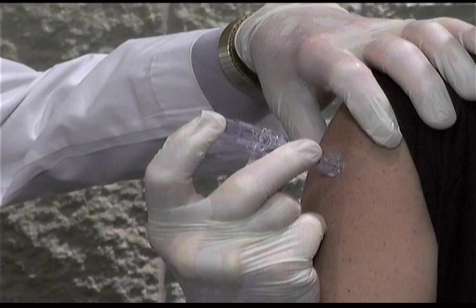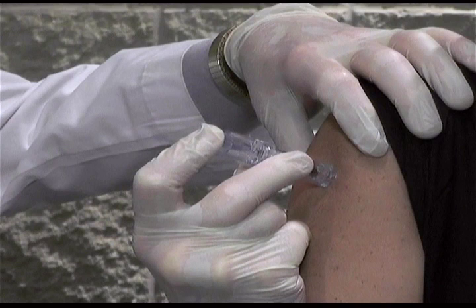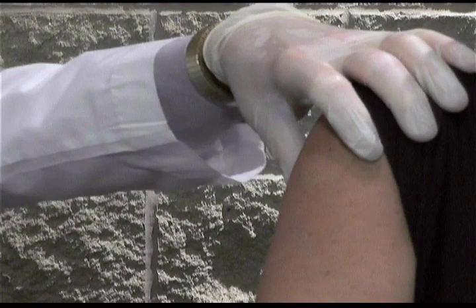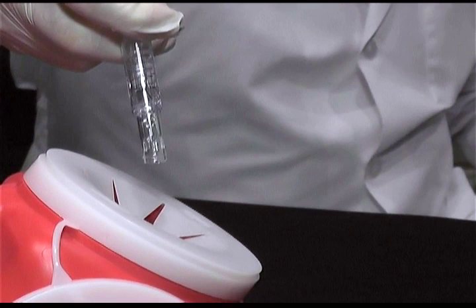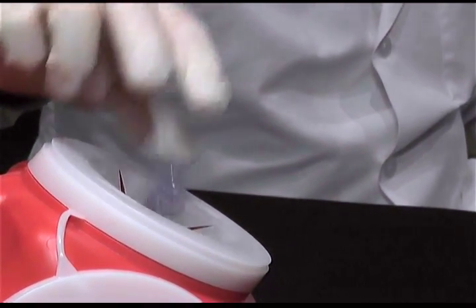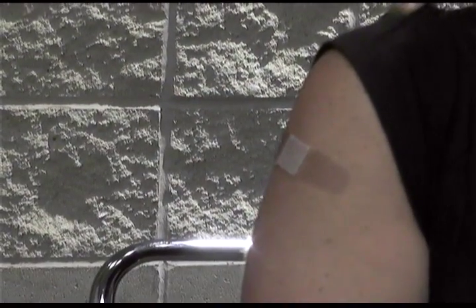Only the plastic tip of the device should touch the skin's surface; there should not be any dimpling or depression of the skin. Weight or muscle mass does not change the technique. Press the plunger with the index finger — be careful to press only the plunger, not the entire device against the skin. Do not aspirate. After the injection is complete, remove the device from the skin. The injection is considered valid even if a small amount of vaccine leakage is visible on the skin. Point the device away from the patient and yourself, then eject the protective shield by using your thumb to push firmly on the plunger — you will hear a click as the shield moves into place. Place it in the sharps container and place a bandage on the patient. The vaccination process is now complete.